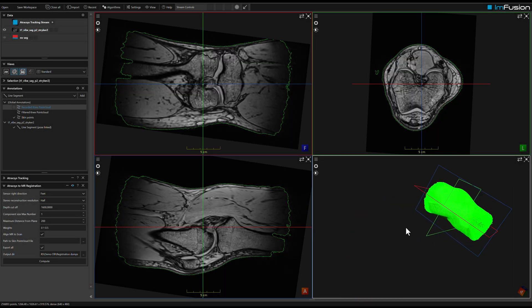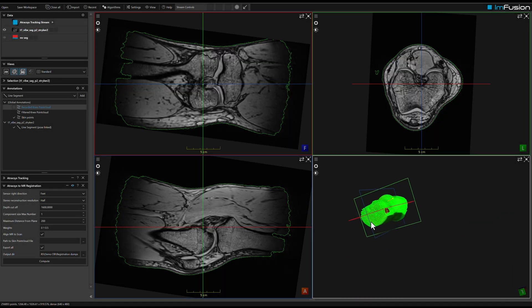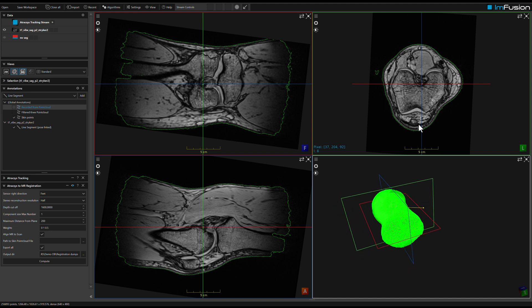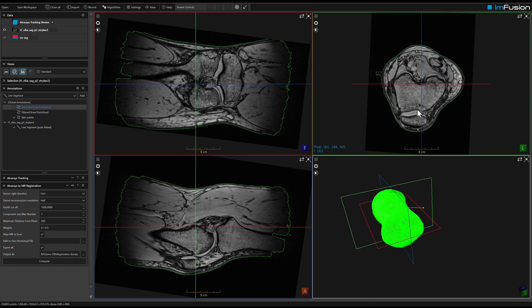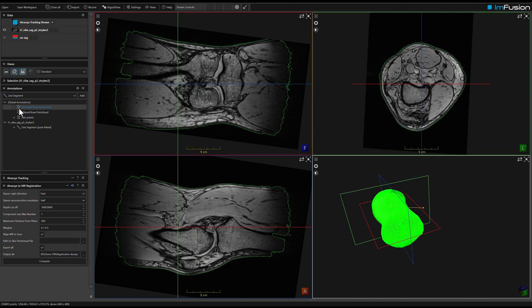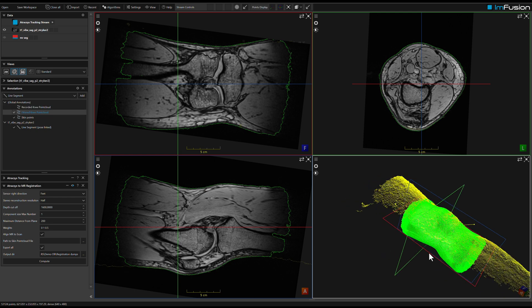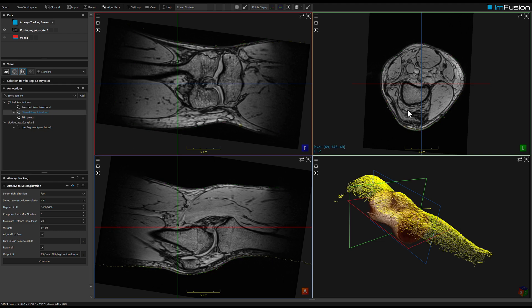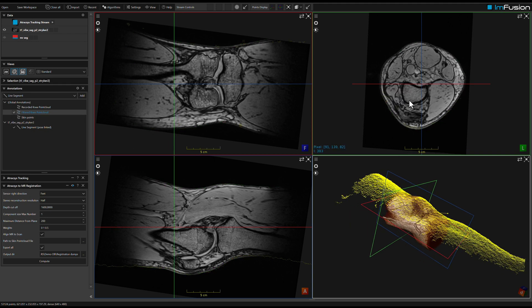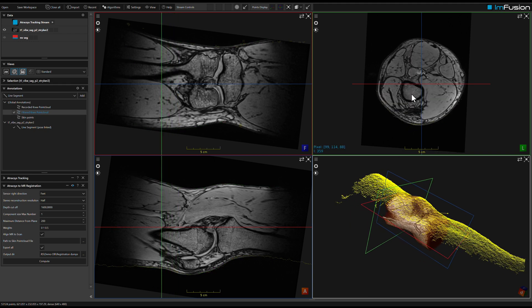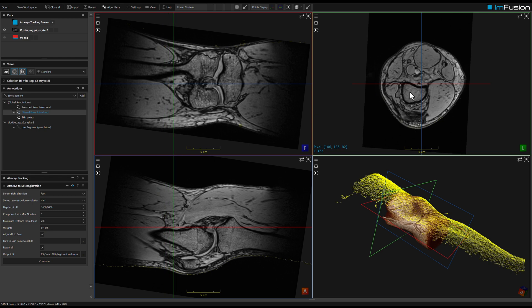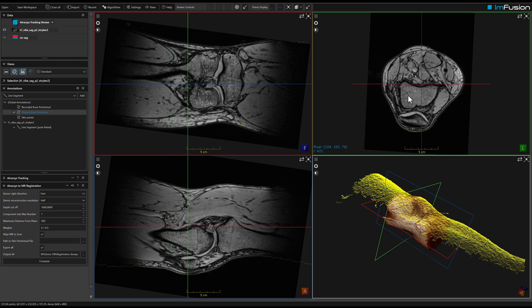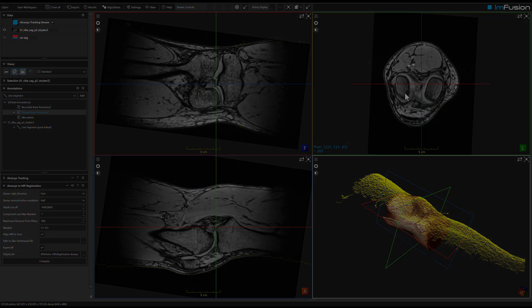The green points show the skin surface extracted from the MR volume. As you can see, the 3D surface scan fits very well to the skin surface extracted from the knee. We can visualise the registration both in 3D and cross sectional cuts in MPR views.